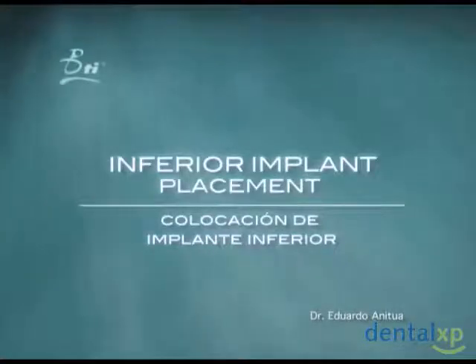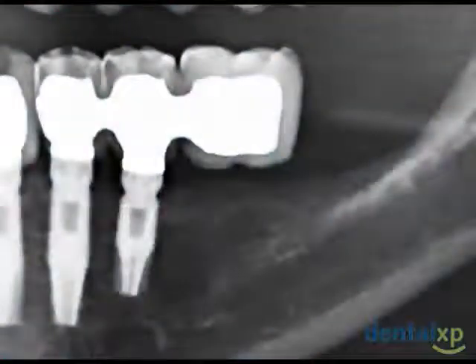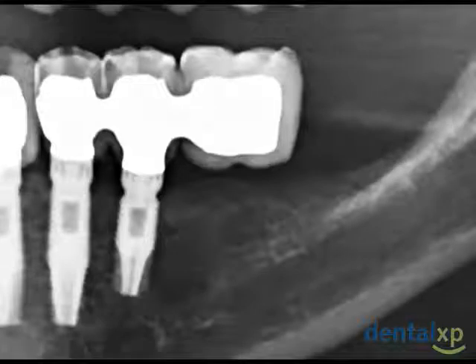Today we will talk about the short length implants. When we have a situation in which a mandible presents with a highly resorptive pattern on the posterior sides, the use of short length implants may represent the ideal tool to treat a case.